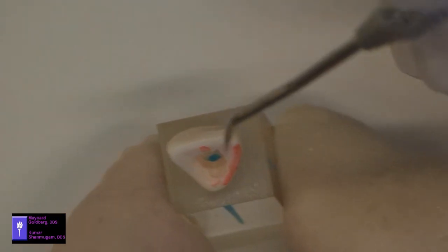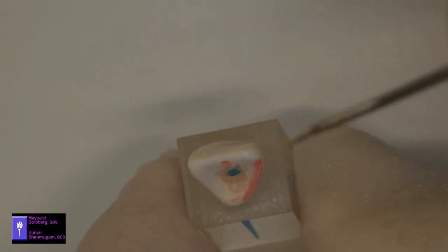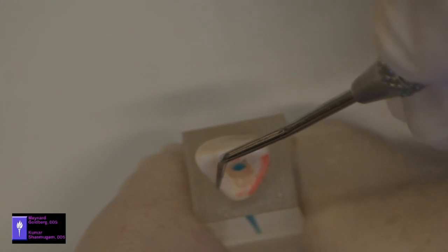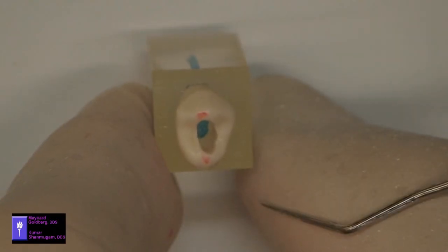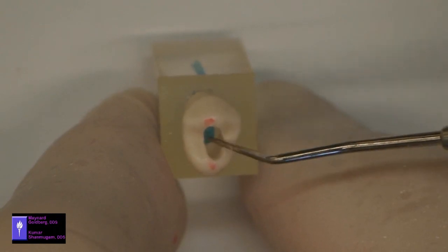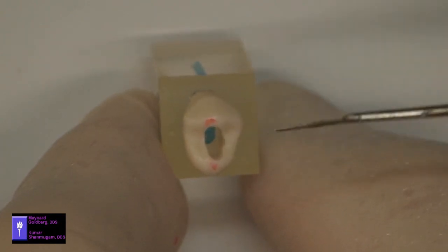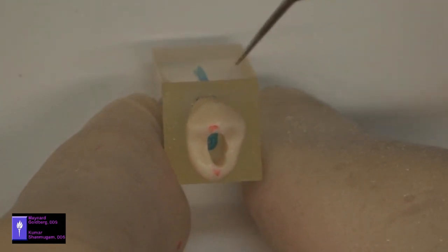Also, the poor positioning encroached too much on the marginal ridge. As a result, the access cavity is not between the marginal ridges. In this access cavity on the maxillary premolar, the wall was encroached upon, the marginal ridge, thus thinning out this wall and making it more prone to fracturing.